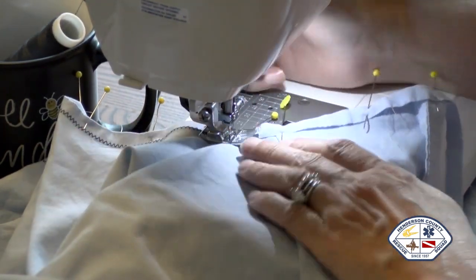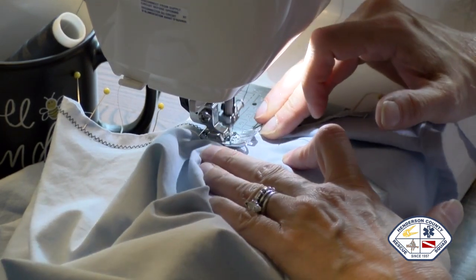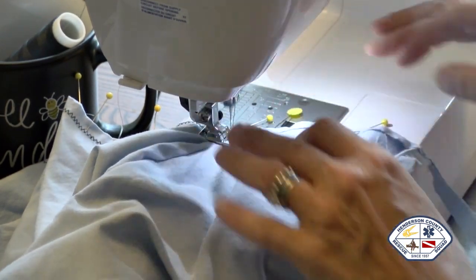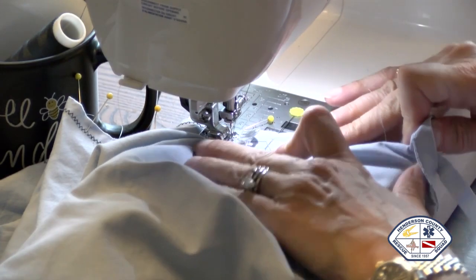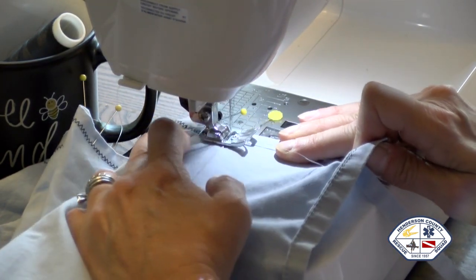There we go. Back at that corner. Let's see, get right there to the seam. And that's your shoulder seam. That's where you're going to have to kind of wiggle it around, and try not to get too much of your fabric.